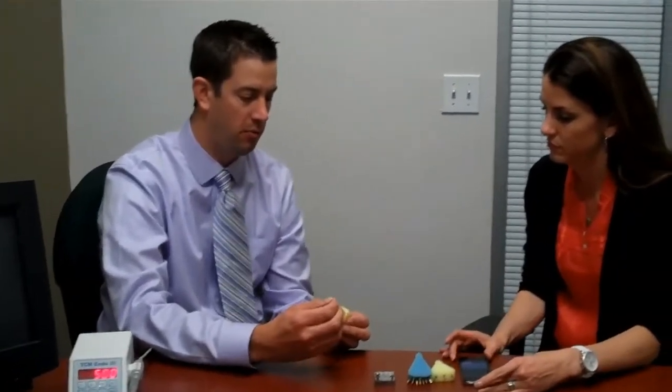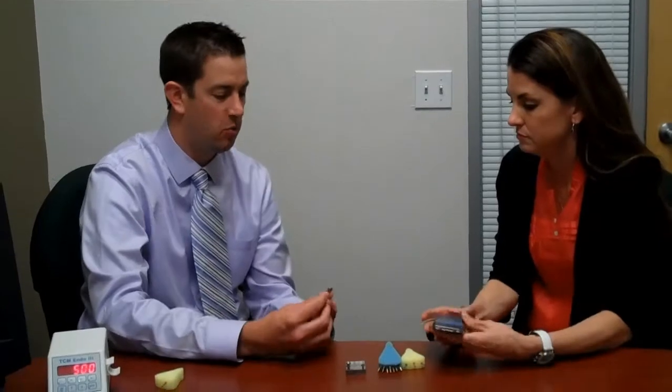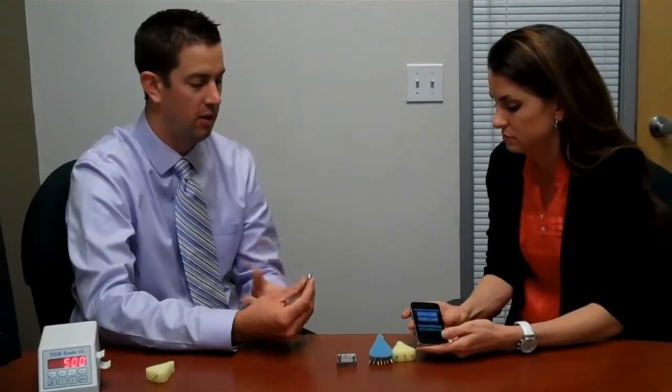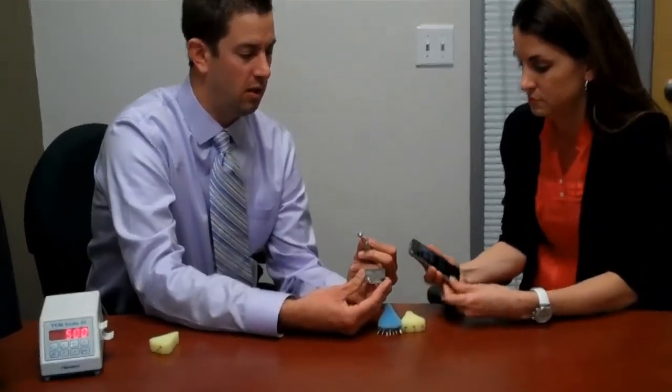What I'm going to do is a short demo to show you — the same thing we do in the office to show how these files are superior to everything else out there. What I've got here is a ProTaper F2, the file from Tulsa Dental that's been out for a long time — the most common file on the planet. This is a ProTaper F2, a 25, and that's where a lot of dentists will stop doing root canals. We're going to do a simple demonstration using a simulated curved canal.